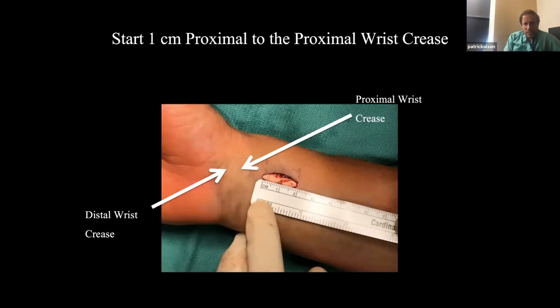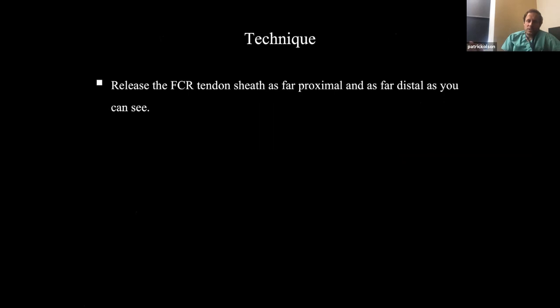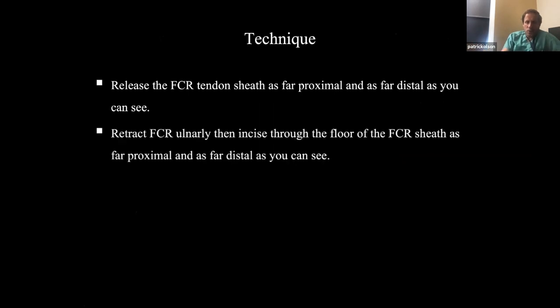You have to be careful where you start. This patient is a little swollen — you can see it better in the video. You have the distal wrist crease, then the proximal wrist crease. You want to go one centimeter proximal to the most proximal wrist crease. Your starting incision will seem quite proximal, but it will land you right on top of the fracture. Then go two centimeters beyond that. That starting point is really the key.